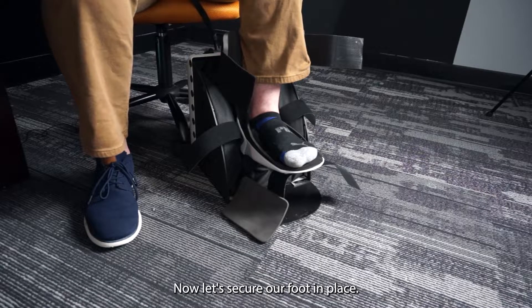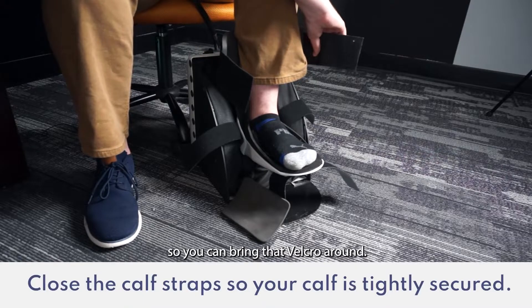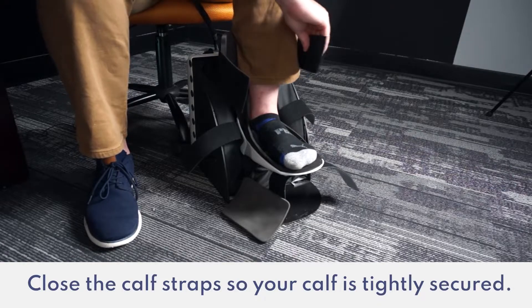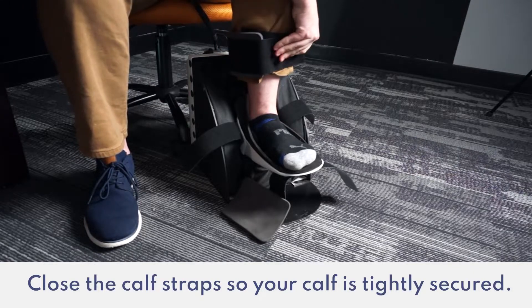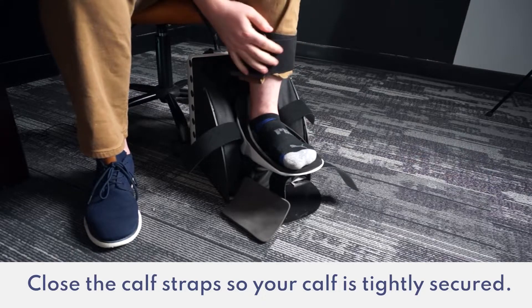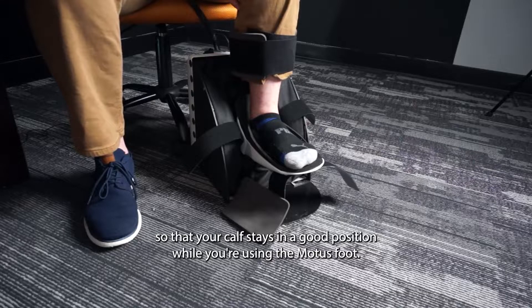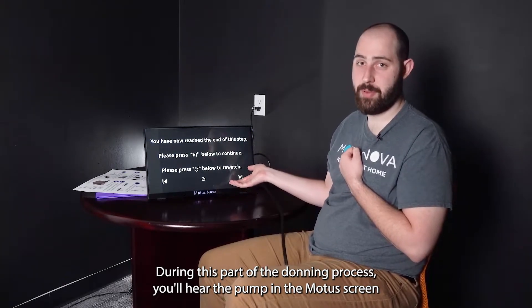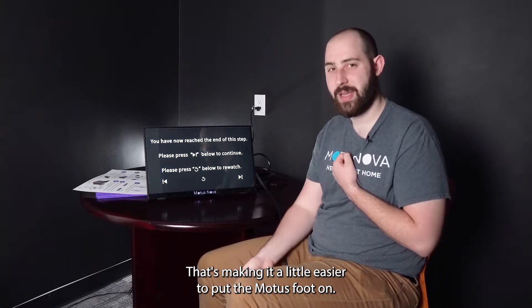Now let's secure our foot in place. The first thing you'll want to do is tighten the calf cuff — bring that Velcro around. You'll want to secure the Velcro so that your calf stays in a good position while you're using the Motus Foot. During this part of the donning process, you'll hear the pump in the Motus screen come on. That's just it regulating the assistance that's making it a little easier to put the Motus Foot on. Totally normal.